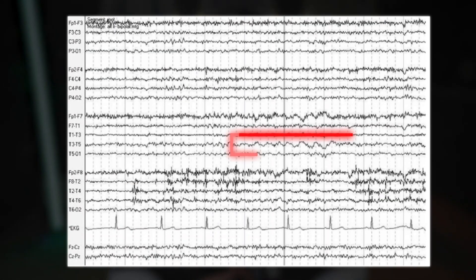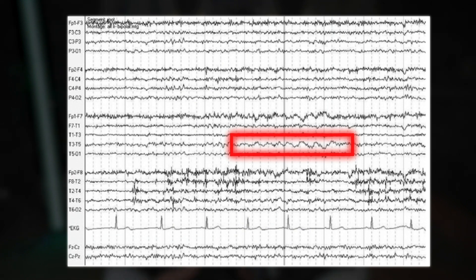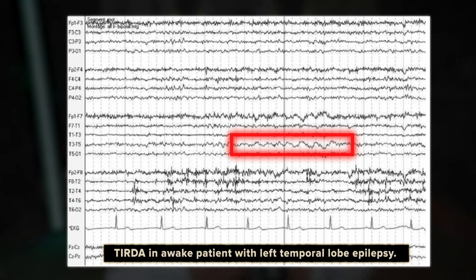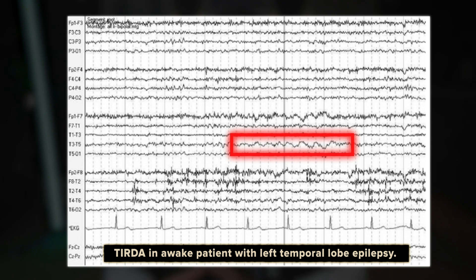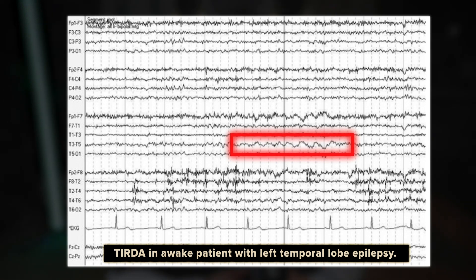In this EEG sample, we see TIRDA in an awake patient with left temporal lobe epilepsy. The recording shows brief bursts of bisynchronous bitemporal TIRDA, which is clearly abnormal. Here's why.